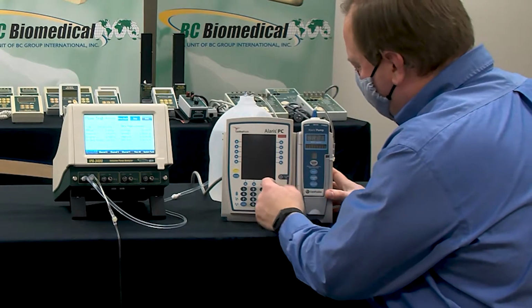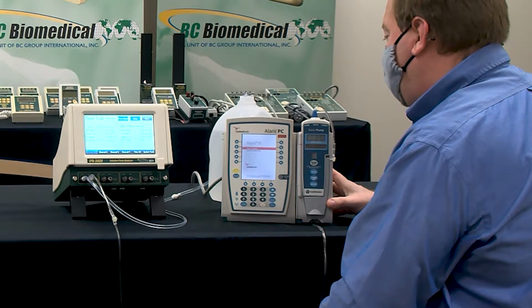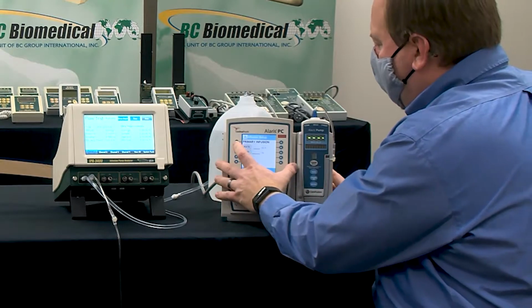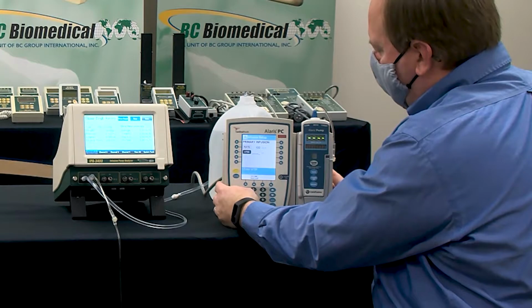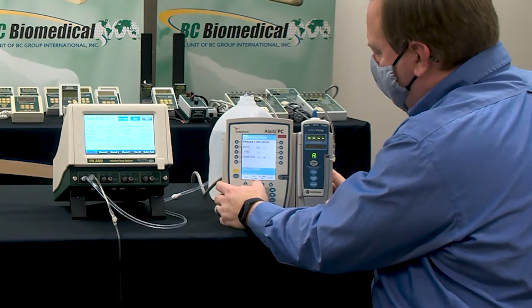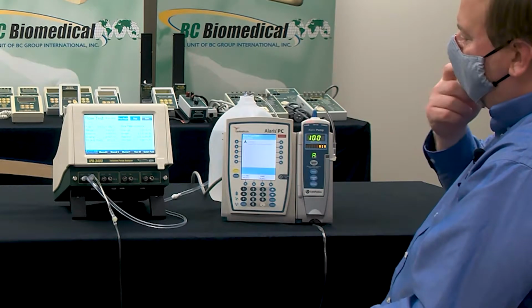By the time I get my pump going, let's see, yeah, turn it on here. Okay, so we'll see if it's patient. Yes, we're on channel A. We have to set a rate. We want to do 100. And we want to do 10 milliliters. Oh, it even calculates it out. Look, there you go, 6 minutes. Great. So let's start that. Now it's running 100 milliliters per hour. It's telling me how much flow.